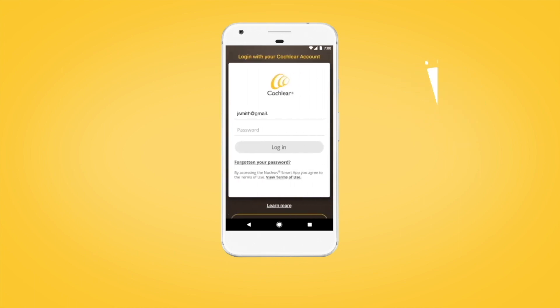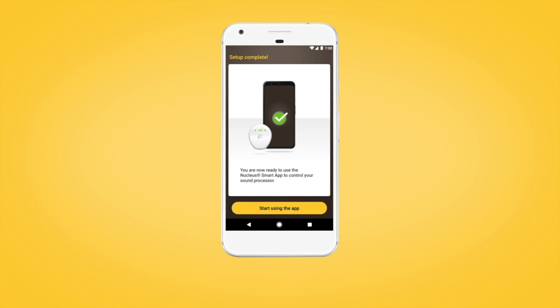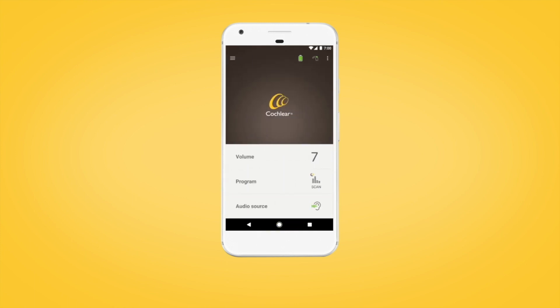If prompted, enter your user details. When setup is complete, select Continue to begin using the Nucleus Smart App.